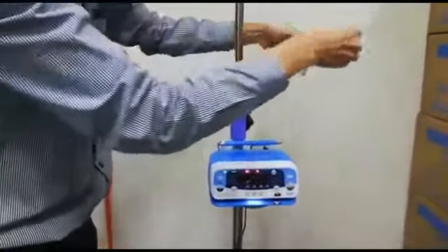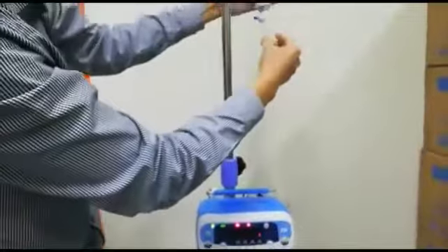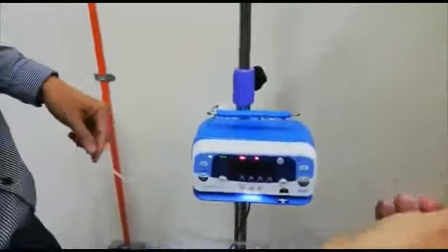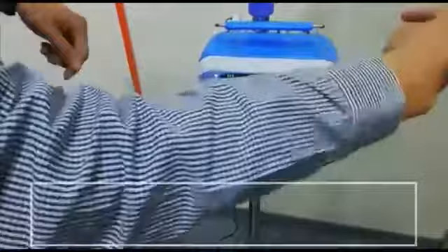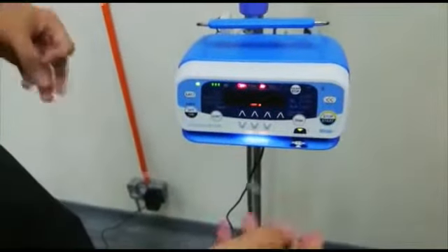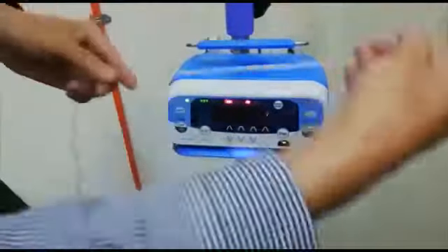This is an example of a general IV set. As usual, you have to do the priming. Make sure the air chamber is filled with the solution. Do this priming before going to the patient. Now you switch on the pump. Make sure your tubing, because this pump runs horizontally, goes from this side to this side. Follow the arrow here. The arrow means this end is to the patient. So you cannot do it the other way around. The solution comes down, but if you go this way, that will be wrong. This is the correct way.